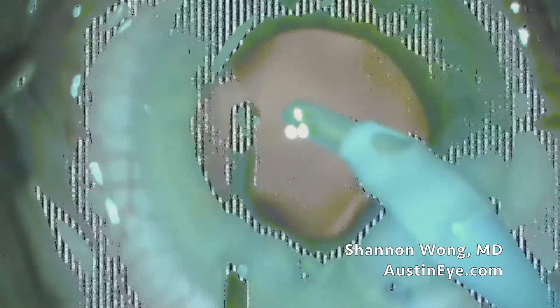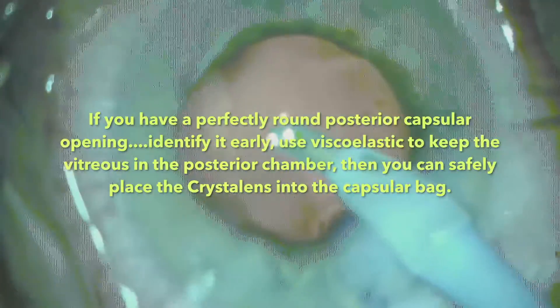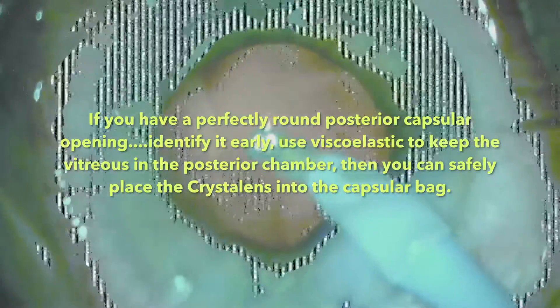We've made a 5.5 millimeter diameter capsulotomy. We've removed the nucleus, and on irrigation and aspiration, we have inadvertently created a small, perfectly circular opening in the posterior capsule.